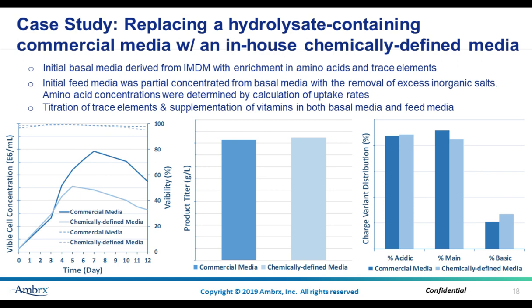In this study, we tried to replace a hydrolysate-containing commercial medium with an in-house developed chemically defined medium. The initial basal medium was derived from IMDM with enrichment in amino acids and trace elements.